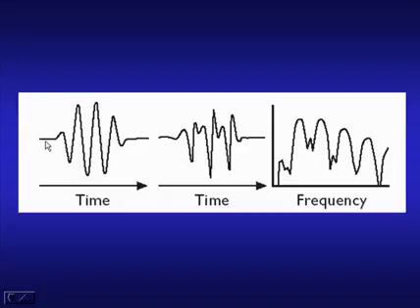So here we see the nice clean input signal. This is the appearance of the signal plus the harmonics. When this is Fourier transformed, we get the various harmonic signals generated. Here's the fundamental frequency. This is the subharmonic at half the frequency, twice the frequency, 3 times, and so on. And we can separate out these signals using filtering techniques really very effectively today.